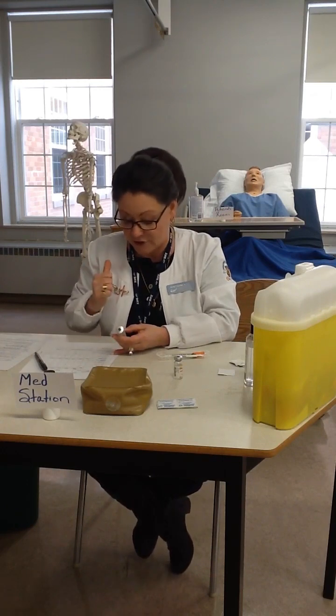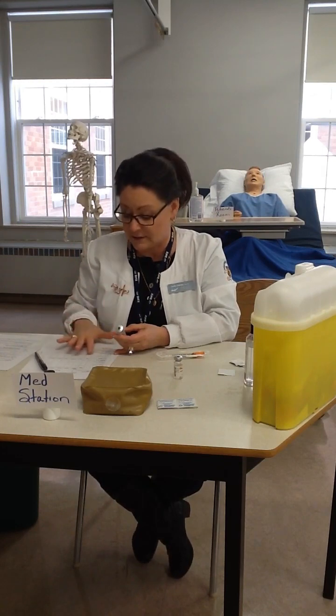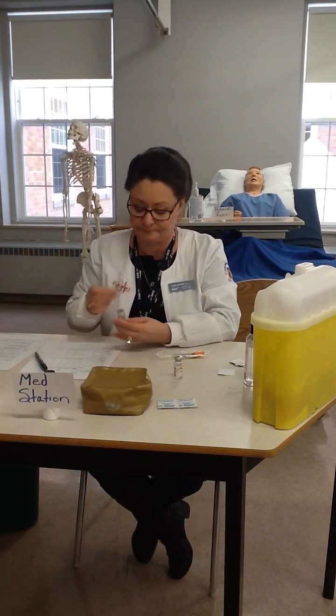check it. I've given Jesse the right education. I know the right reason. I've given him the right to refuse. Documentation will happen at the end, and evaluation is ongoing. There's 2 solid checks. I'm feeling really good about my safe medication preparation here.